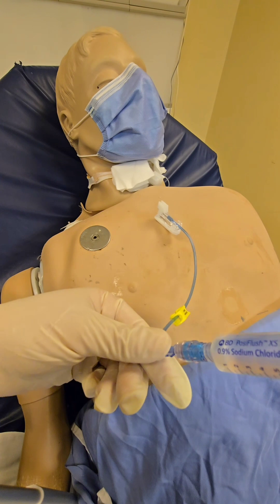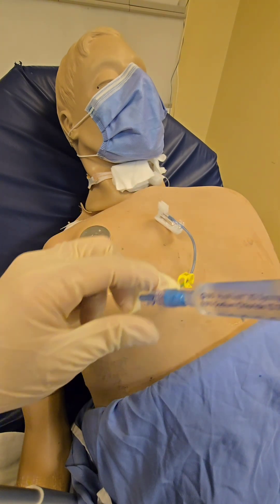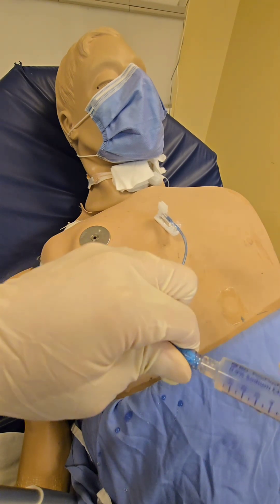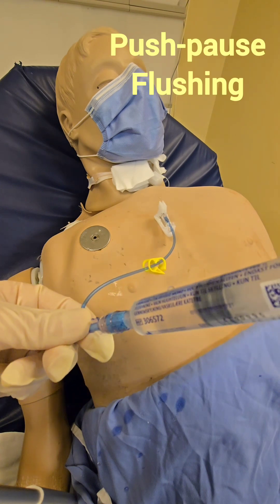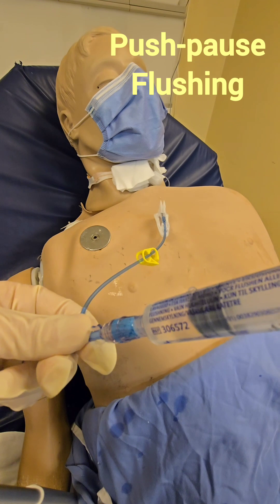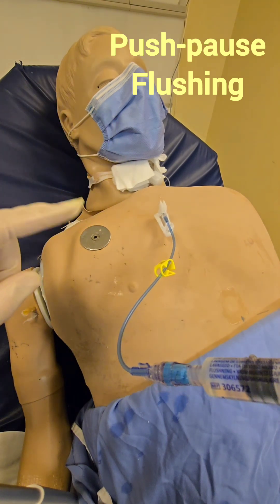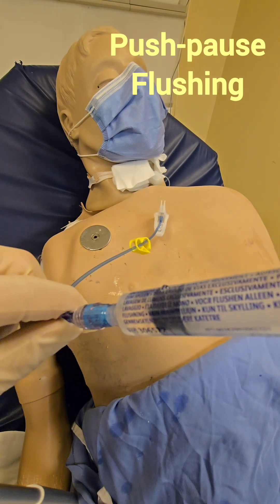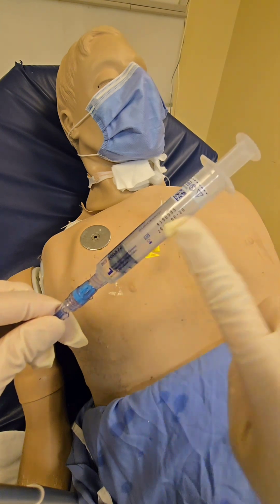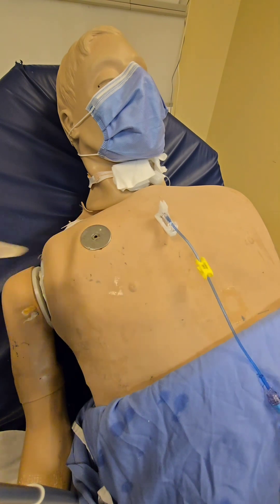When you flush, use the push-pause method: push-pause, push-pause, push-pause. This is the method to flush any central lines. If you don't flush with push-pause your lines will clot despite putting heparin inside. Make sure you flush the same way you learned in nursing school — push-pause — with 10 cc's. If that's not sufficient, try 20 cc's as well.